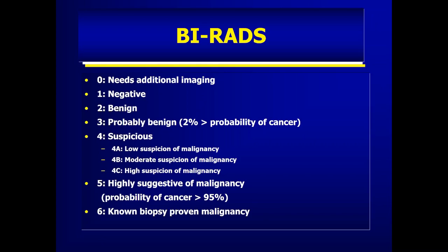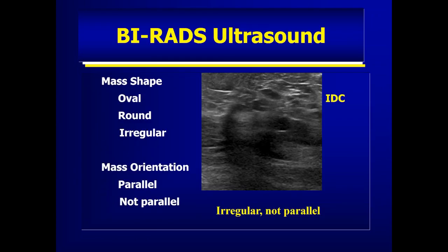And the next BI-RADS, we're not sure when that'll come out, but there may even be another category, perhaps for lesions that have been treated non-surgically that are being followed. So that probably will be a part of the next BI-RADS. So let's go through the BI-RADS lexicon a little bit here.